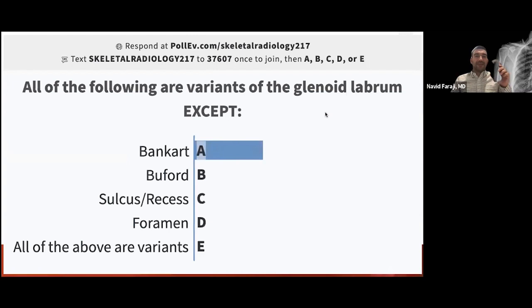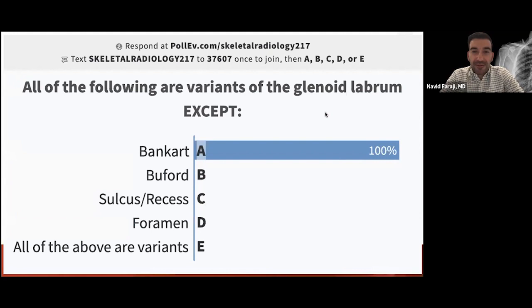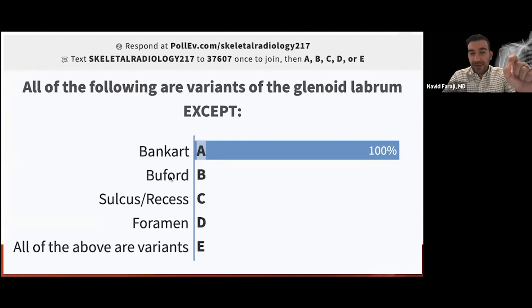Poll question: which of the following is NOT a variant of the glenoid labrum? The Bankart lesion is not a variant — it is a pathology of the osseous glenoid or soft-tissue labrum. The Buford complex, sublabral foramen, and sublabral sulcus are all normal variants. We need to know these variants and normal anatomy before discussing pathology.